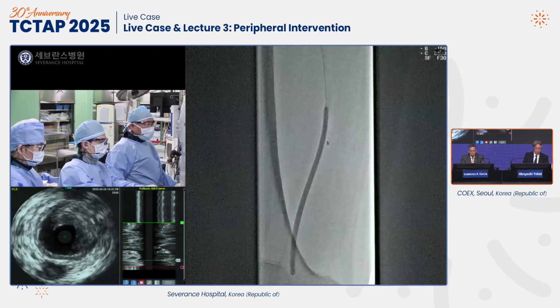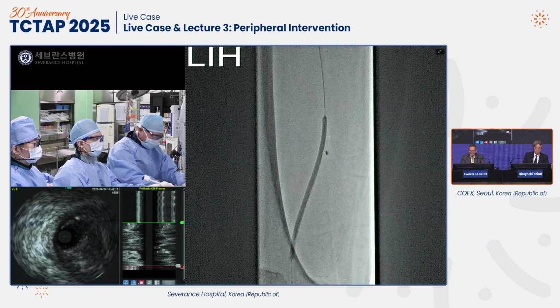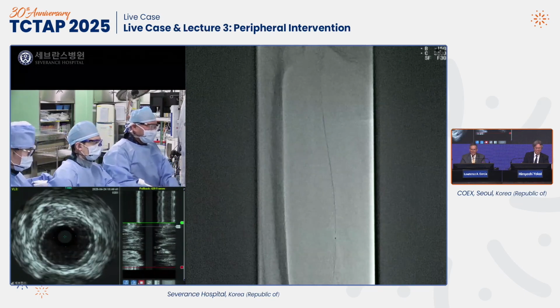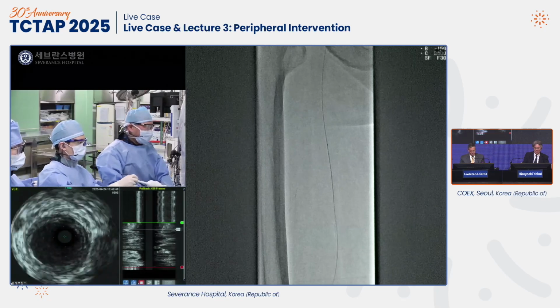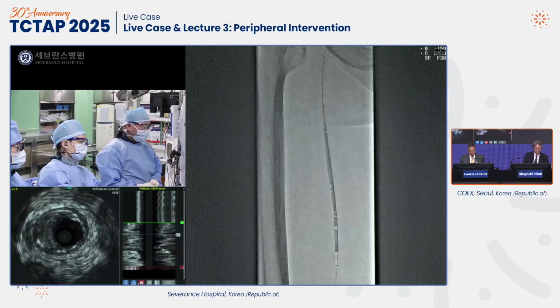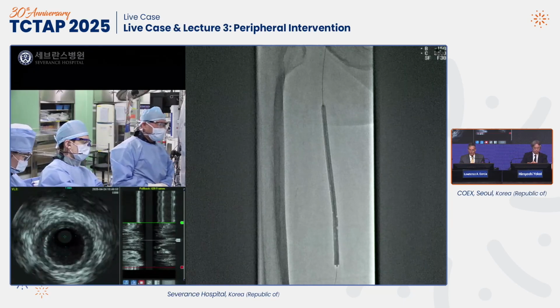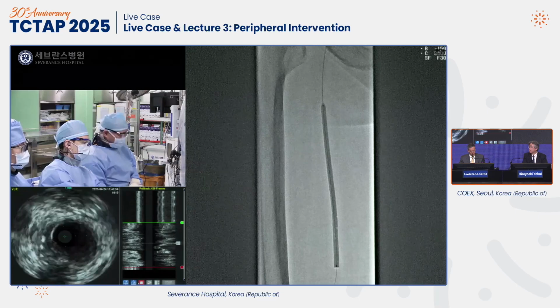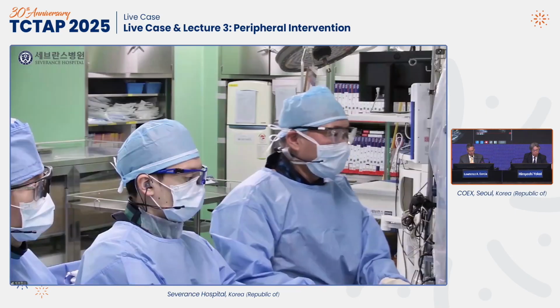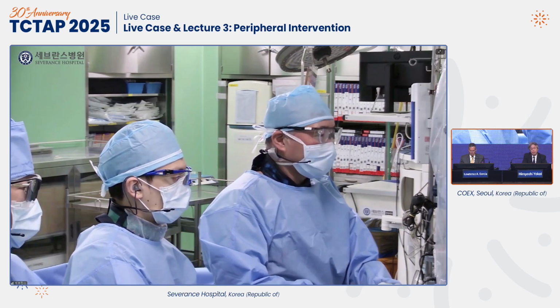Okay, deflation. Even though you recommended 5-minute inflation, because of the limited time, I have to do it a little bit quicker. Yeah, no, that's an eternity in these live cases. Why don't you continue with your pre-dilatation, and we're going to move on to our lecture, which is from Dr. Yoon, and then we'll be checking in with you in about 8 minutes. Dr. Yoon is going to be discussing infrapopliteal endovascular intervention, strategic selection, and outcomes of interventional revascularization.